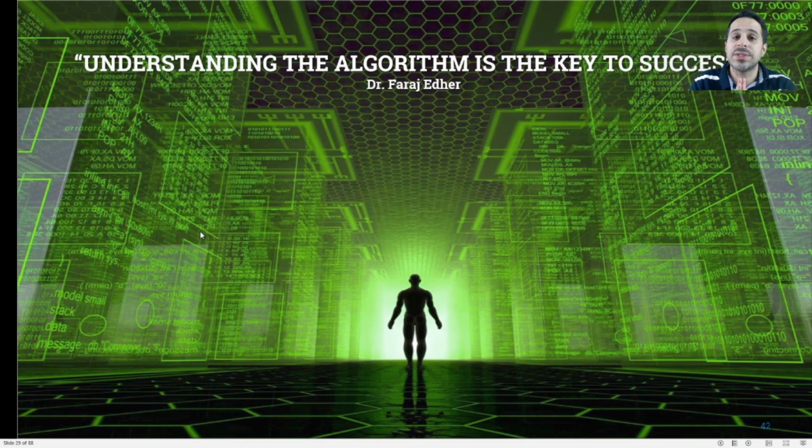You need to understand the concept of digital dentistry: what kind of tools you need to use, where to use those tools, how you can implement them, the idea to get the maximum benefit from implementing digital technology in your daily practice.